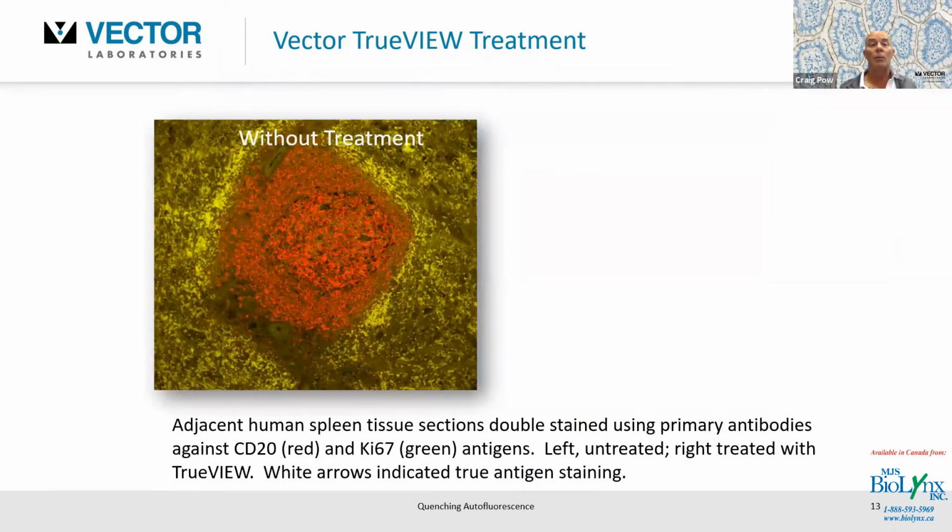Another particularly problematic tissue that some investigators work with is human spleen or spleen tissue. And this particular image here does not have any treatment for reducing autofluorescence, but it is a double stain. So this gives you an idea of the retention of that specific signal, but the drop in the background when you treat with TrueView on this next slide. But I think it's important to show these side by side.